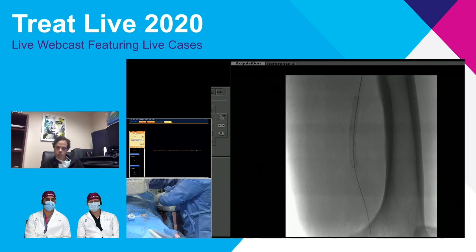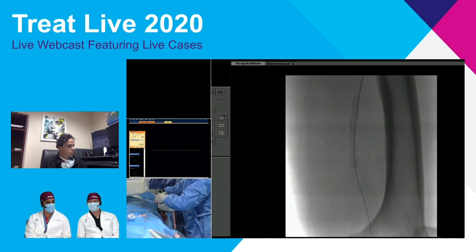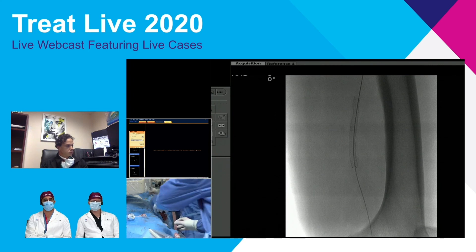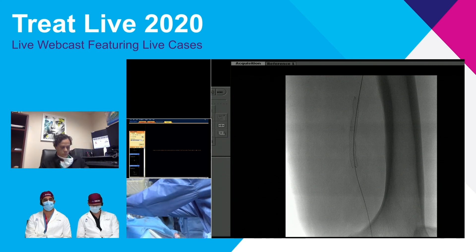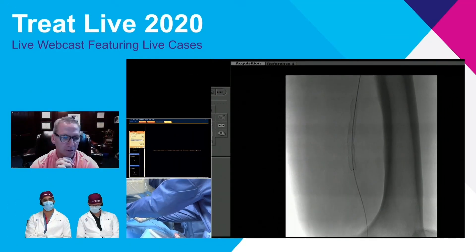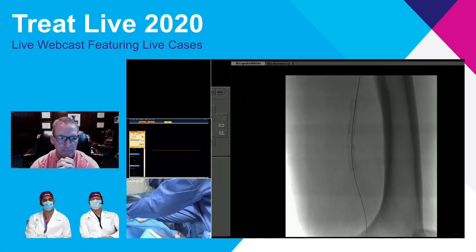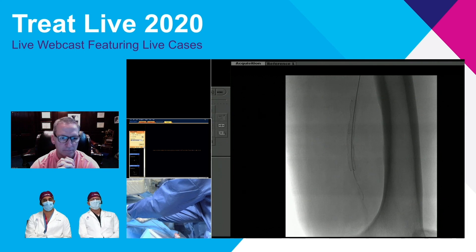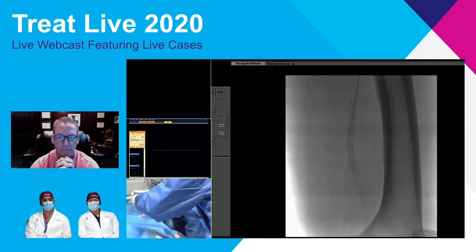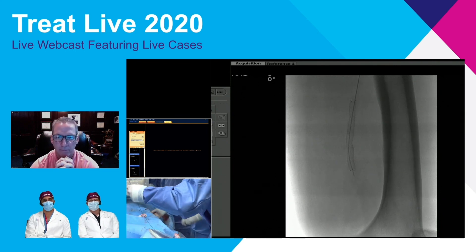We're going to check the post-stent imaging quickly, and then move over to room five. I think there is a proximal problem — do you see the contrast still a little bit hung up? I agree. Once we pull our sheath back and dilate that proximal segment, I think we'll be okay. The plan is probably to treat that with a 5-millimeter balloon — we'll see. I'm going to shoot this first and then decide.